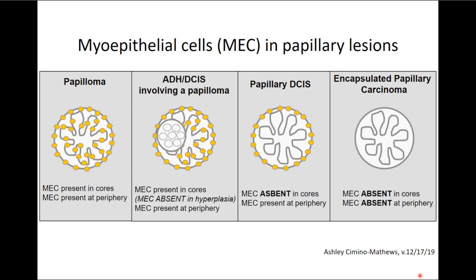And I do want to make a note, because it's clinically important, that even though we're calling this encapsulated papillary carcinoma, or the other variant, solid papillary carcinoma, although we're calling them carcinoma, they appear to behave the same as ductal carcinoma in situ. And it may be that they're kind of in transition, or they lack the myoepithelial cells but still have basement membrane. Whatever the case may be, they should be staged as pTis. So they're staged as in situ carcinomas.